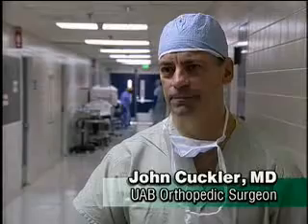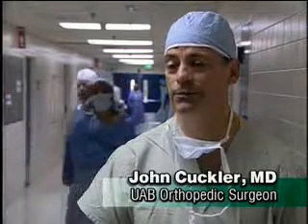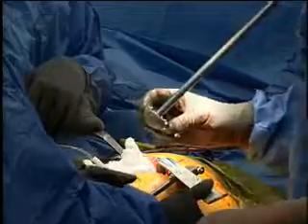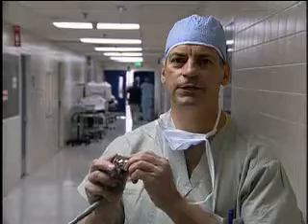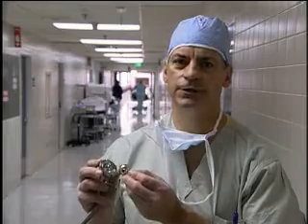"The metal-metal hip will wear at a far slower rate than the metal-plastic hip, which is our traditional hip design." The new technology uses a metal ball with a metal socket. These are very highly polished, with very close tolerances. This design wears at one one-hundredth the rate of the metal-against-plastic design.